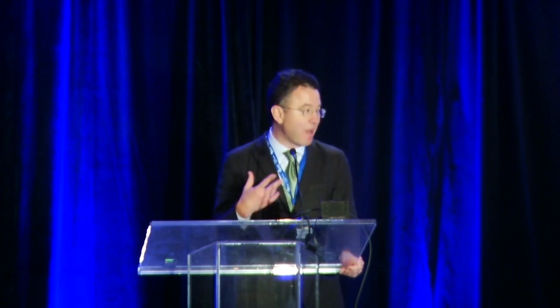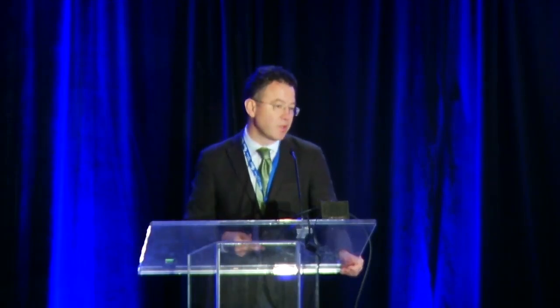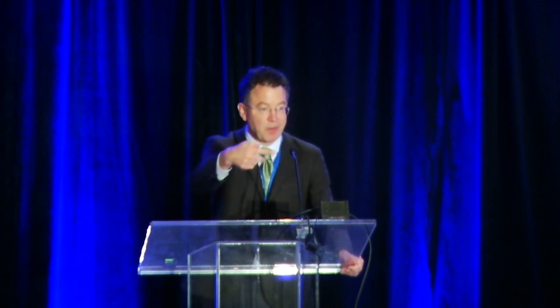I will tell you that increasingly there's a small number of neurocritical care programs around the country, I know UCLA is one, a few more, that have now started to routinely monitor intracortical EEG when they put bolts in. And we intend to do that too. But we want to go stepwise for everyone. So we're doing PbtO2, we use the Raumedic PTO, pressure and tissue oxygen, we're adding microdialysis through a simple dual lumen bolt, and then we'll just keep pushing it. But we want to end up there, yes.